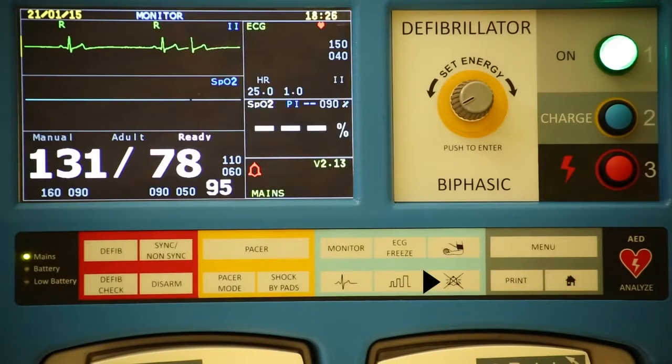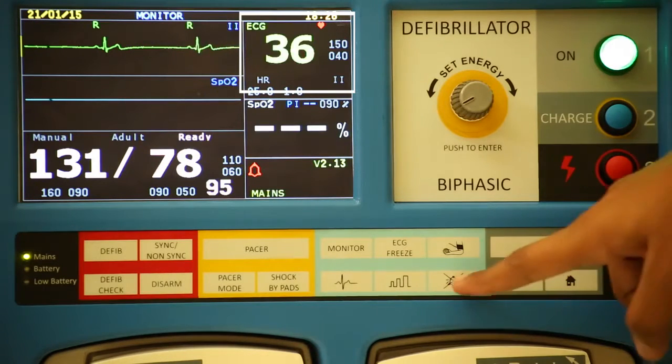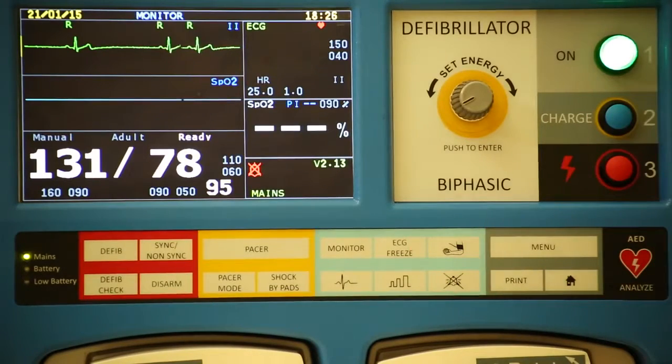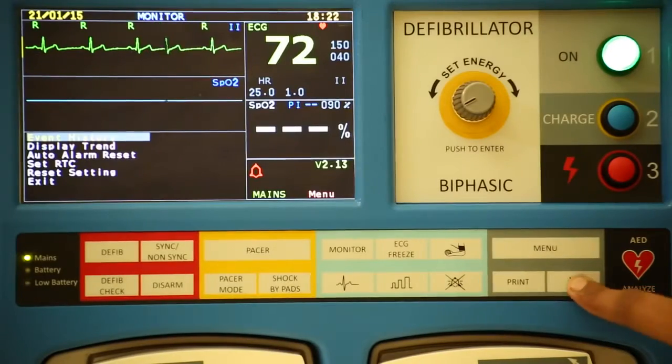The audio alarm on and off key is provided to switch the audio alarm on or off. Audio alarm starts ringing when any value of the parameter goes out of specified limit values. Particular parameter value starts blinking. The bell is displayed with a cross sign when the alarm is manually turned off. The home key enables the users to come back directly to the main screen from the menu.